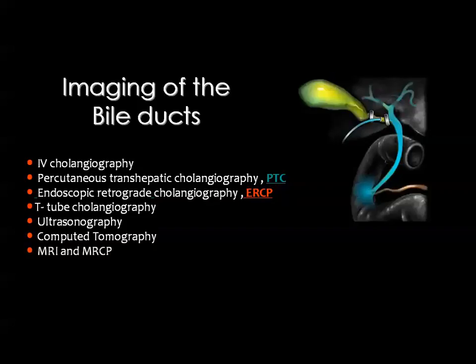with the imaging of the bile ducts. And there are a lot of investigations also to evaluate the bile ducts, including this very old obsolete technique which is known as intravenous cholangiography, which is no more used in clinical practice.